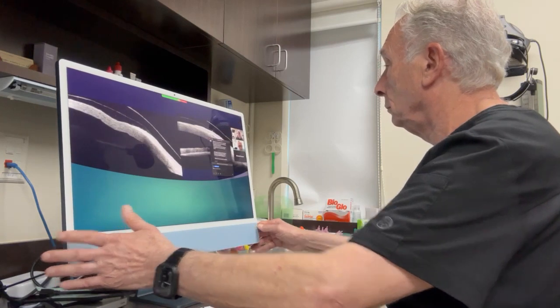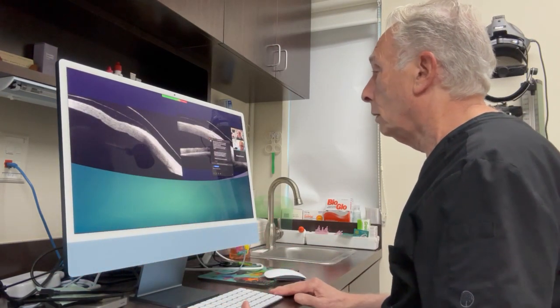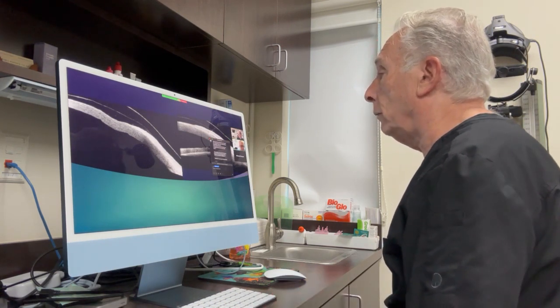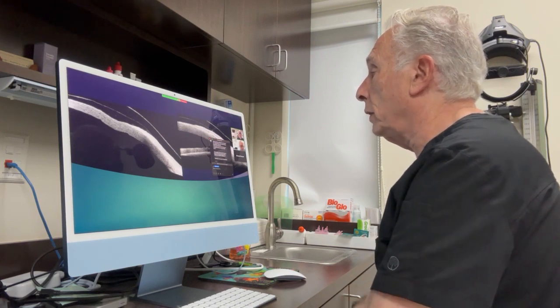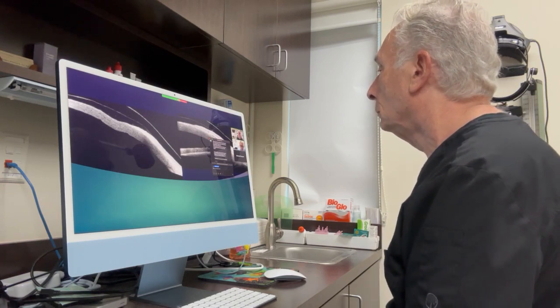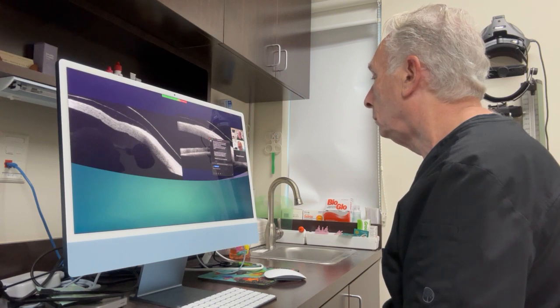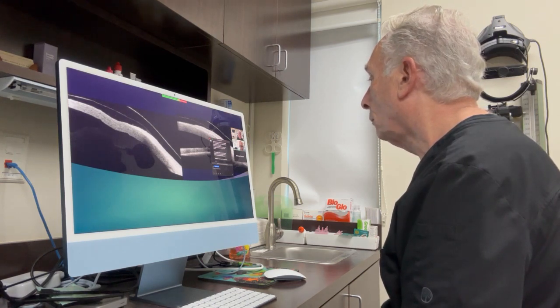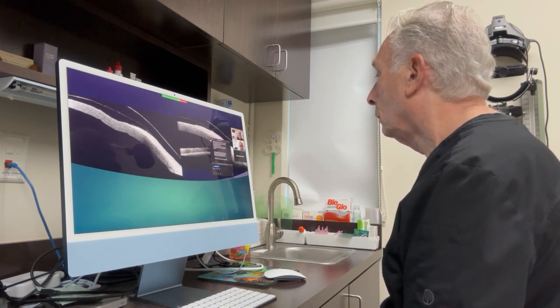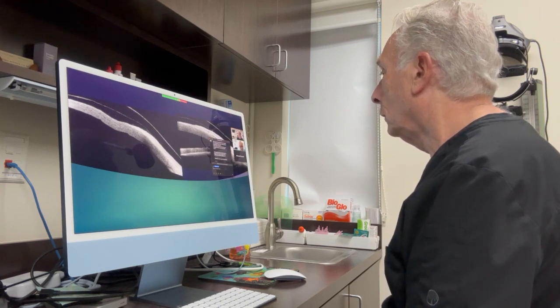So, of course, you spend most of your time on lenses. Most of the time, you don't do general optometry. No, we don't do anything with eyeglasses. Everything we do is contact lenses, mainly scleral lenses. Yeah, that's right. It's a new development, I think. With OCT, we can see the clearance, we can see the landing, we can see everything. You can also even see the angle. Yes.